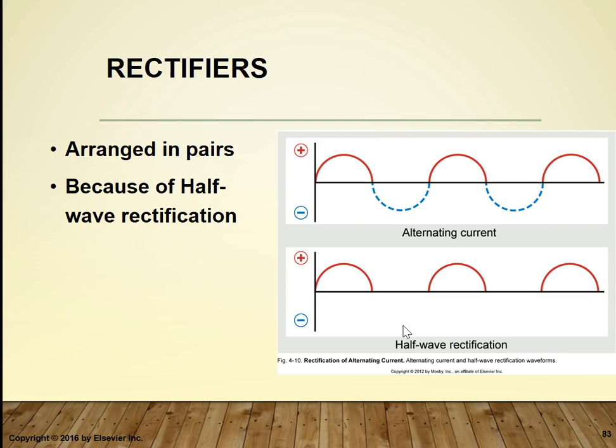it has an open path in each direction. And it's possible to use only 2 rectifiers, but then that suppresses or wastes the negative half of the cycle and only protects the tube during that phase. So one half of the alternating current cycle flows through the x-ray tube and the other half is going the wrong way, or it's blocked.